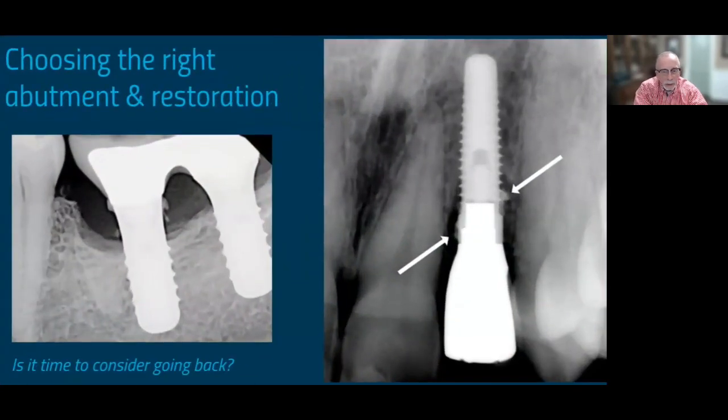Now, on the clinical side, we talked about this bone loss, and we know various ways it happened. But in the beginning, when I first started making implant crowns, they were all screw retained, every one of them. And somewhere along the line, after not too many years, it was determined by somebody somewhere that, hey, why don't we just make the implant abutment like a crown prep and then make the crown traditionally and just cement it on it. So we moved into a phase of cemented, and it quickly became popular. And there was a time when I would say 95% of the crowns were cement retained.